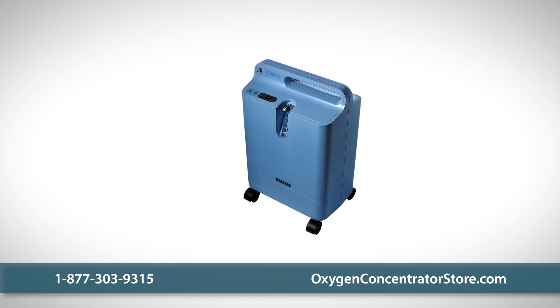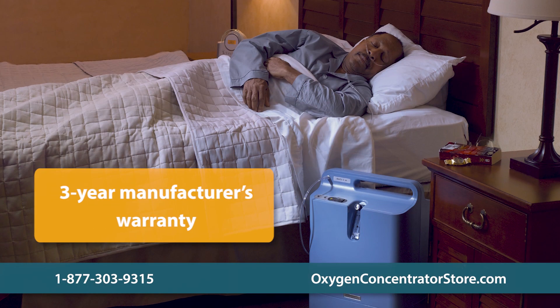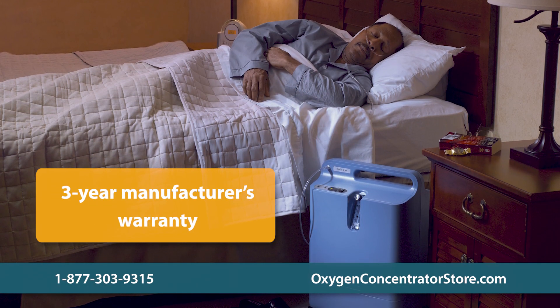Your purchase includes the Everflow unit, a cannula, and a user's manual. We also offer a three-year manufacturer's warranty on the unit.